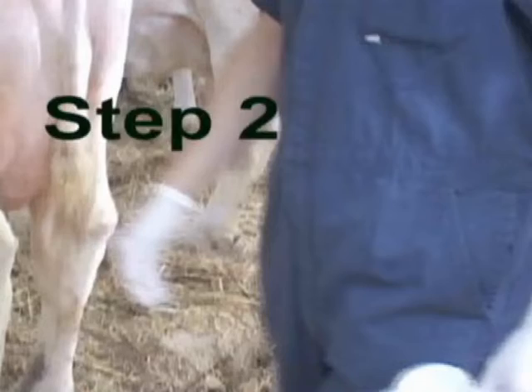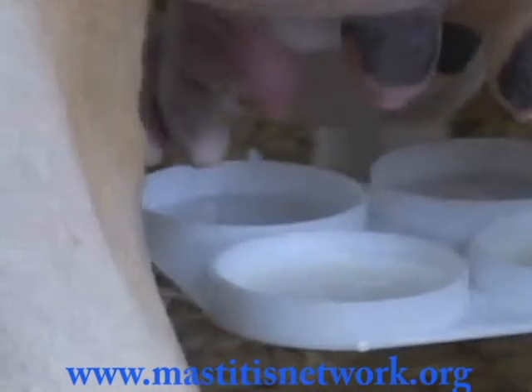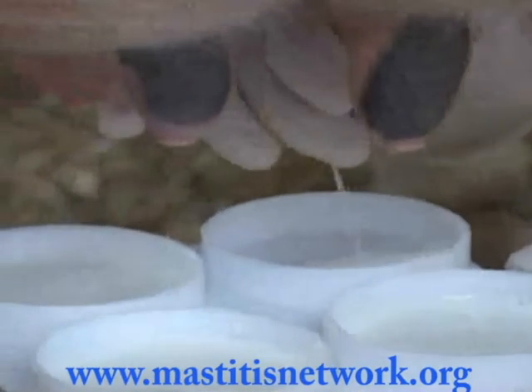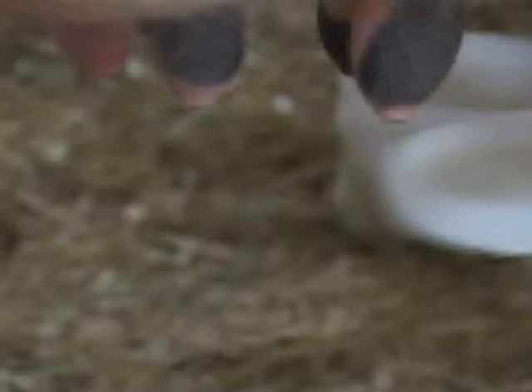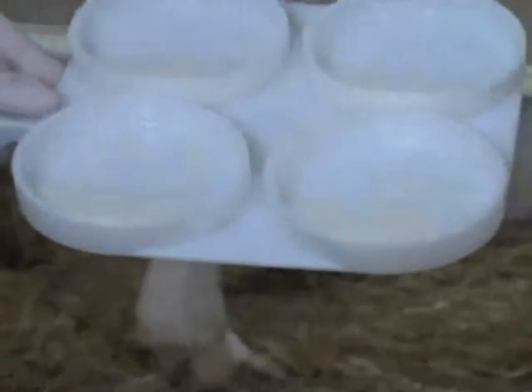In Step 2, always use the same paddle position from cow to cow, always on the same side of the animal, right or left. This will make it much easier to keep track of quarters when interpreting results. Collect milk from each quarter into the respective paddle cup, covering the bottom of each cup. There are two circles in the bottom of each cup, which indicate the amount of milk and reagent that needs to be added for the test.